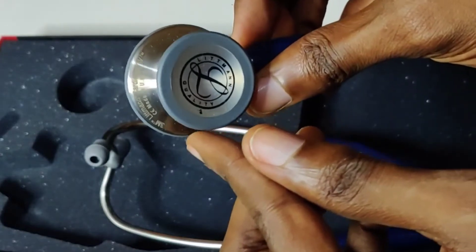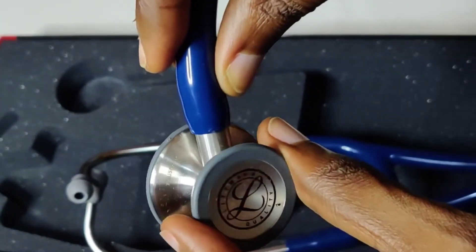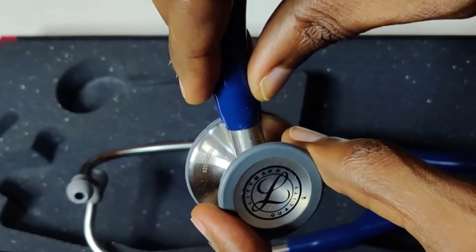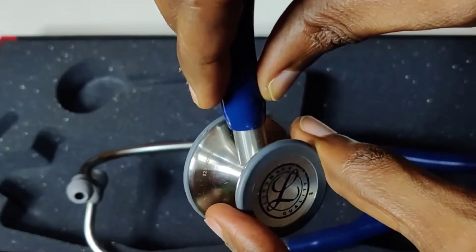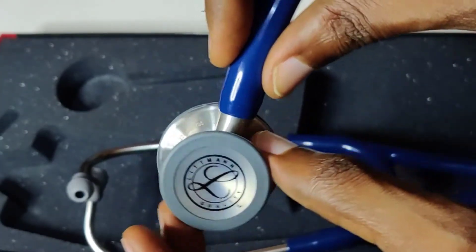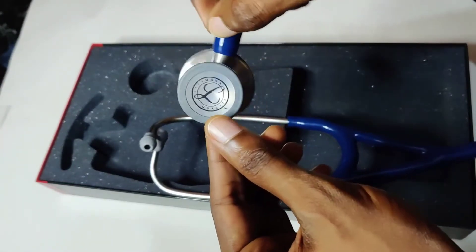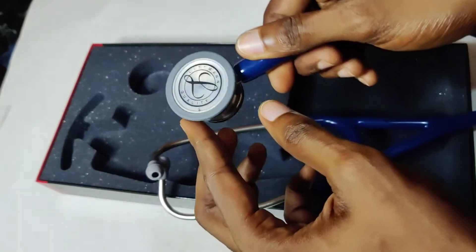It is neatly engraved and you can see 'Made in USA.' On this part we have the serial number of this stethoscope, and you'll notice how aligned and properly written they are, and also notice the spacing closely. The fake would not have the same spacing between the codes and it wouldn't be as neat. You'll also notice how transparent this part is, and how neatly the Littmann logo is placed on this part and here as well.